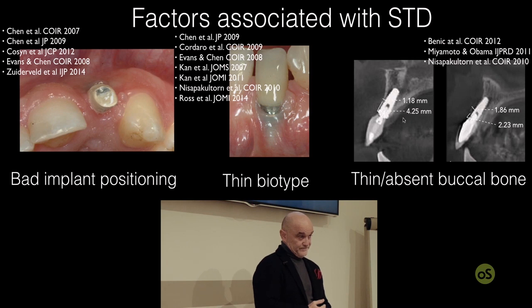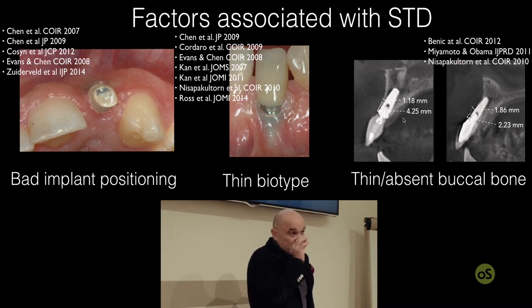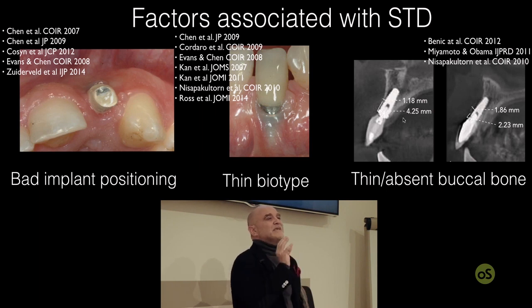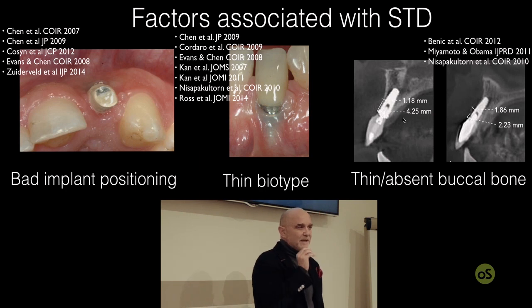To decontaminate the implant surface, because what we are speaking about is not an implant affected by perimplantitis. We are speaking about an implant that is perfectly integrated into the bone that experiences gingival recession because of too much buccal displacement.